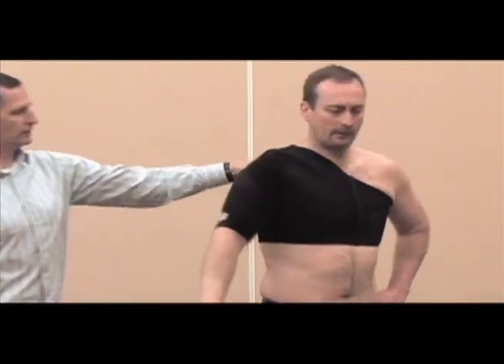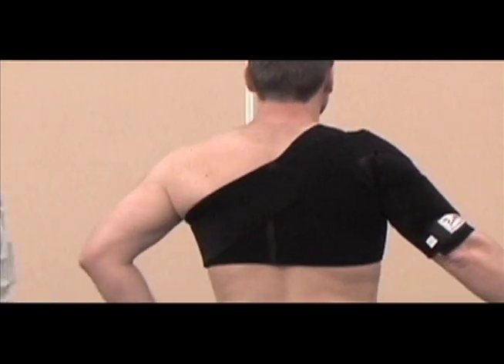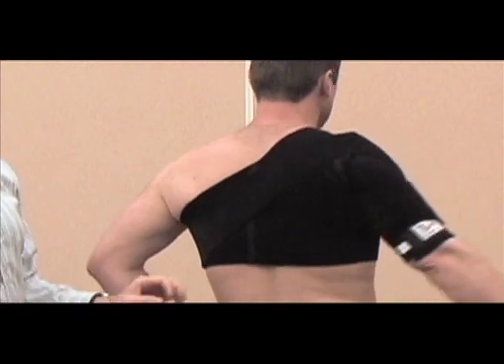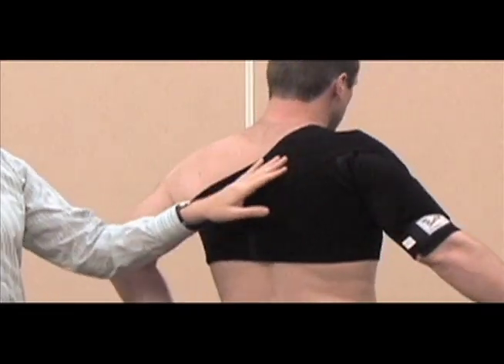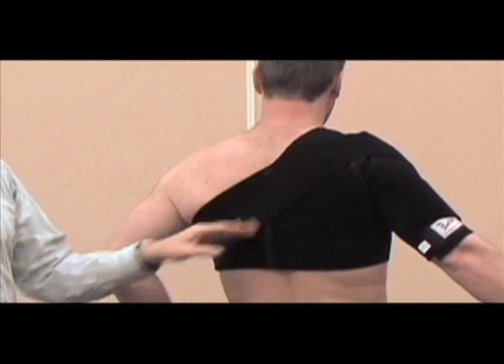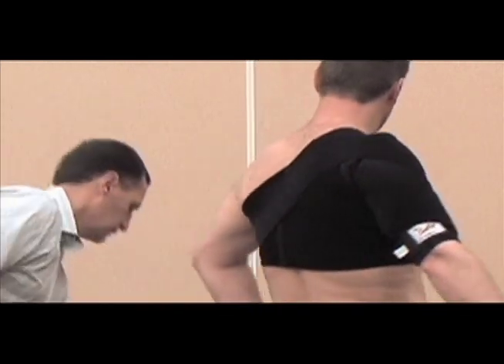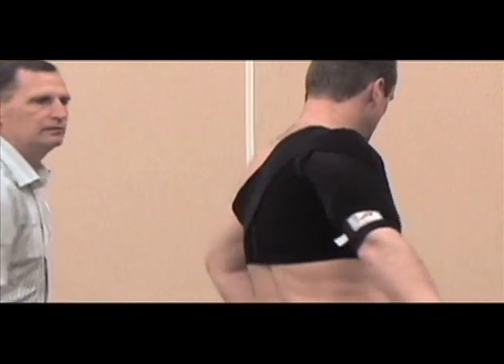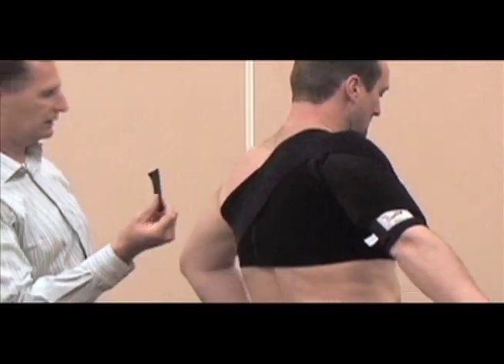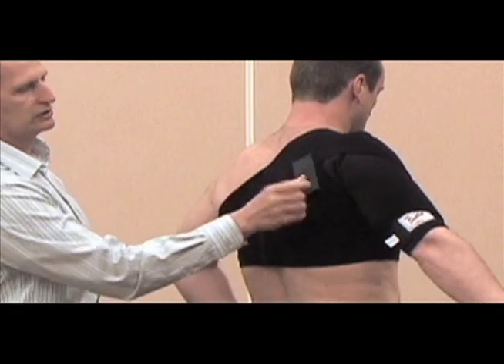For bigger athletes, you'll often have to repeat and overlap the other four-inch strap in the same pattern. If needed, there's migration to the straps — if a strap wants to move, just take a piece of Velcro off one of the other straps and secure them in place.